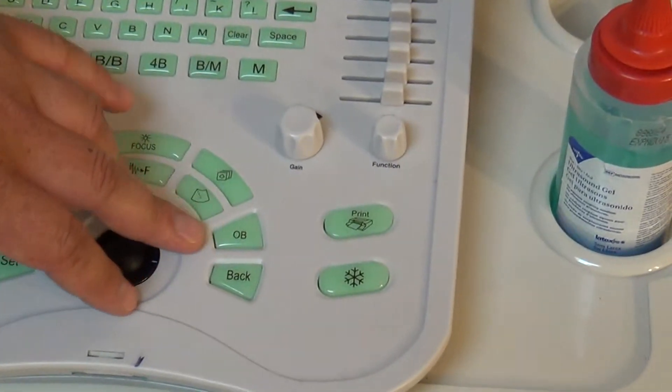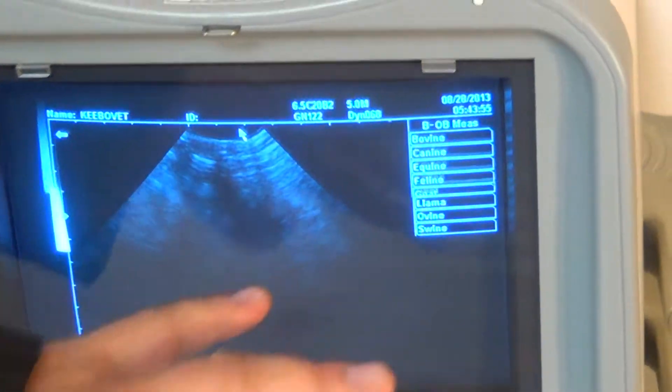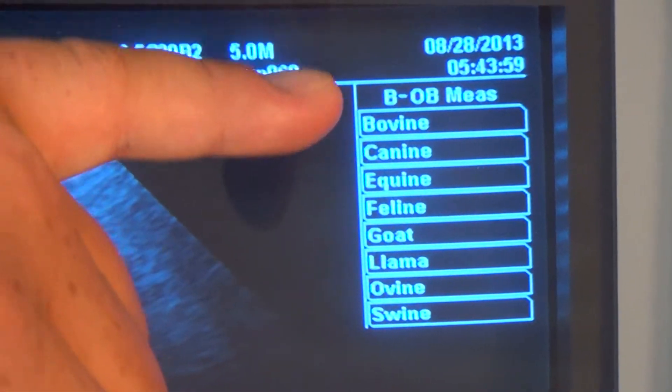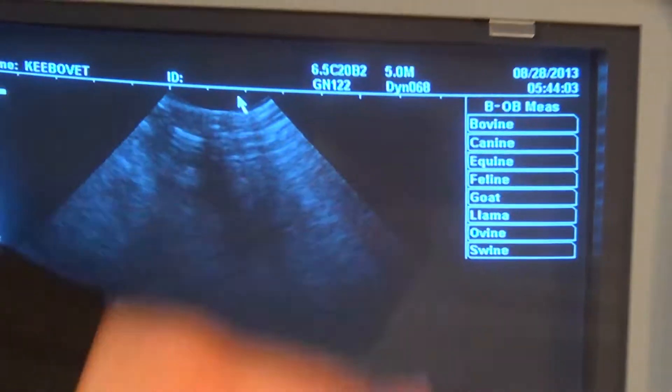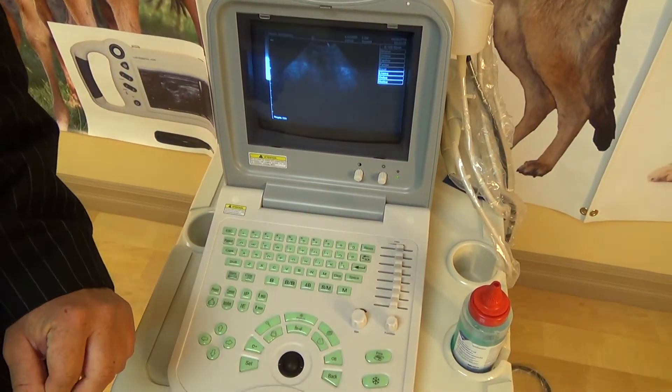Another button that's going to be kind of popular is the OB button, and that brings up the OB calculation packages. This is currently set for veterinary use, so it shows you all the different types of animals we can do. Depending on the type of animal you're scanning, you'll click on that to get that specific OB package set up.